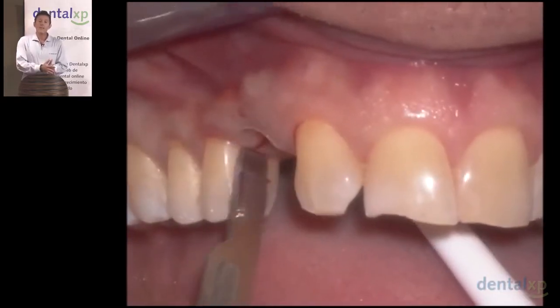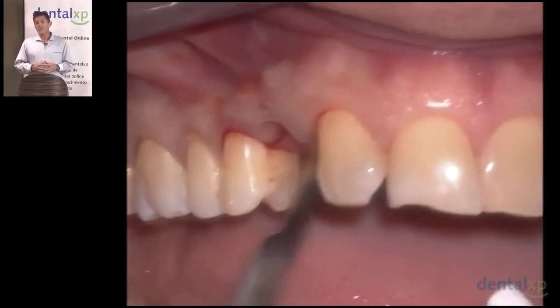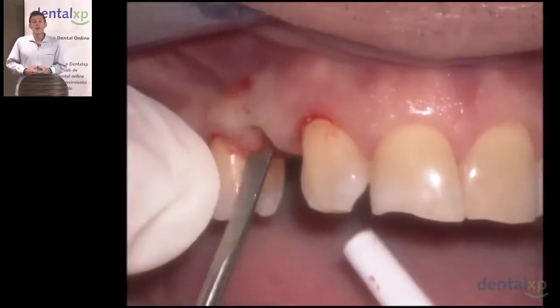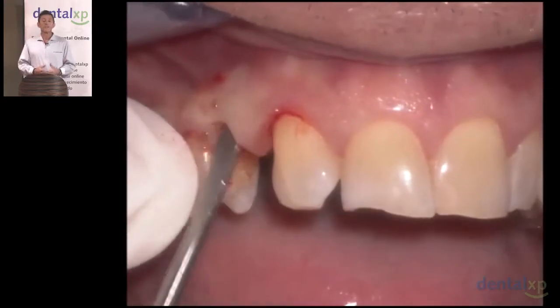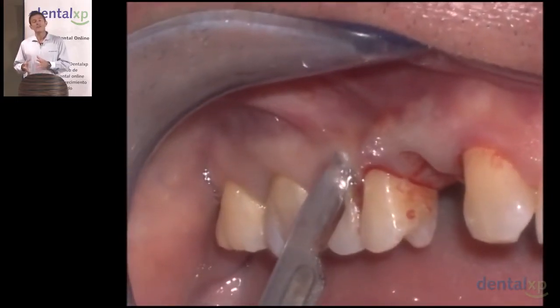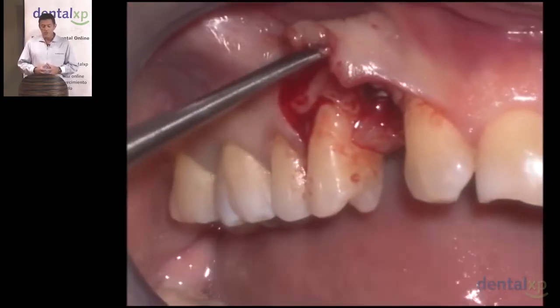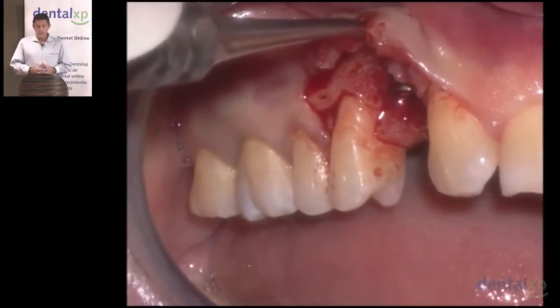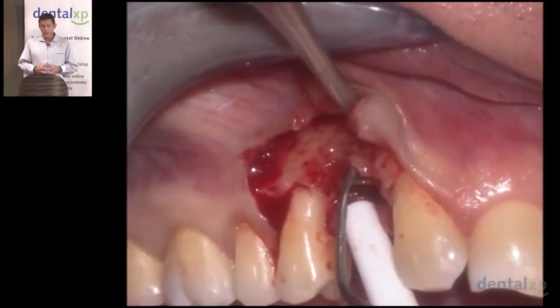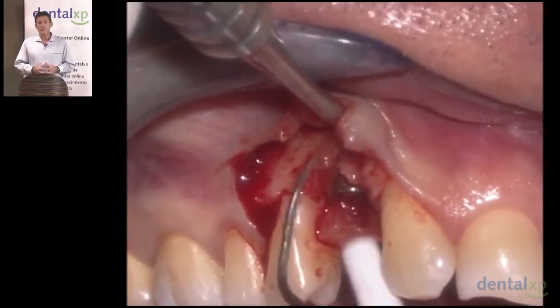Only then can we go back to the surgical site, understanding from the cone beam CT that there would be a bone dehiscence on the labial aspect that needed to be addressed utilizing regenerative protocols. So what we attempted to do here, utilizing modern technologies, is to first process the placement of the implant and indicate the location of that implant within the jaw, and only then address the bone regeneration that needs to be done. This is done through a sulcular approach. A vertical incision is placed behind the first bicuspid, and when we evaluate the position of the implant, you can see quite clearly that there is somewhat of a dehiscence on the labial aspect just around the microgrooves of the Ritter implant.